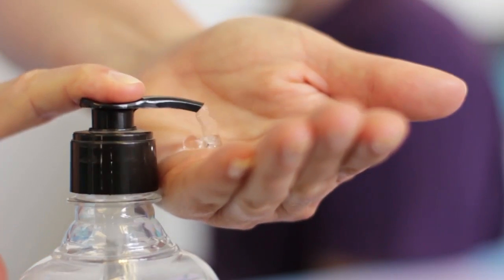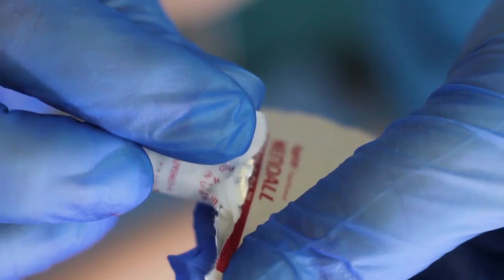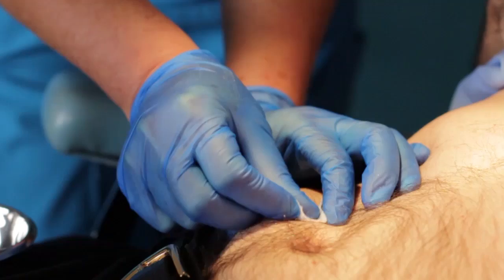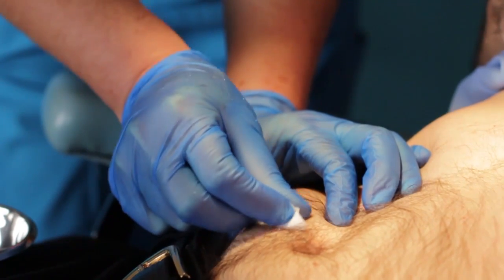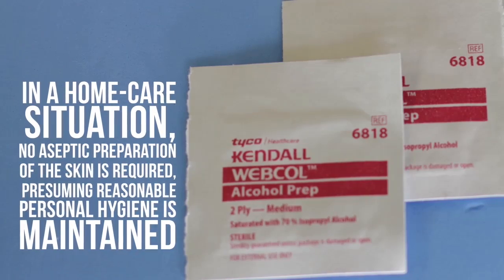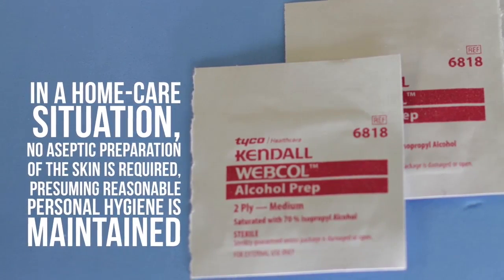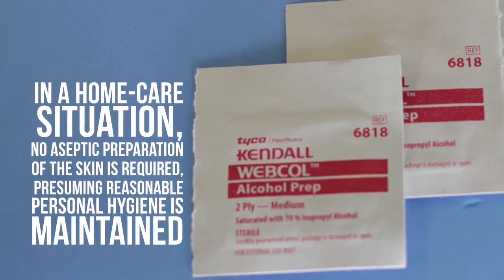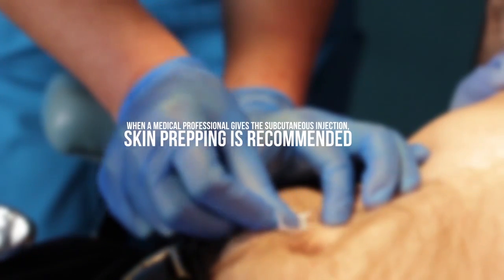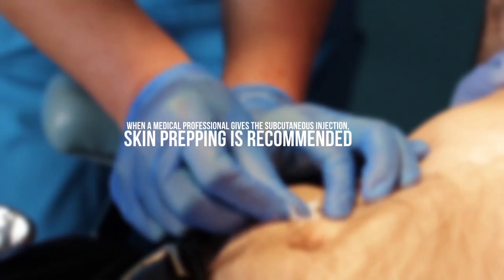Prepare your hands hygienically and don clean gloves. Sterile gloves are not required. Open an alcohol prep swab, wipe the intended injection area, and allow it to air dry. In a home care situation, no aseptic preparation of the skin is required, presuming reasonable personal hygiene is maintained. However, when a medical professional gives the subcutaneous injection, skin prepping is recommended.